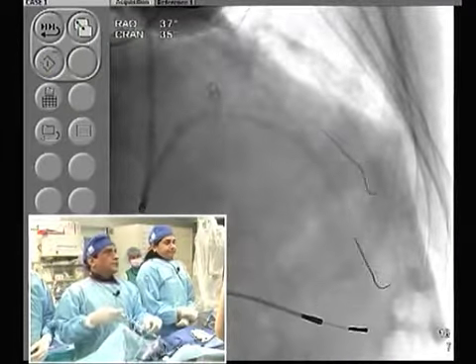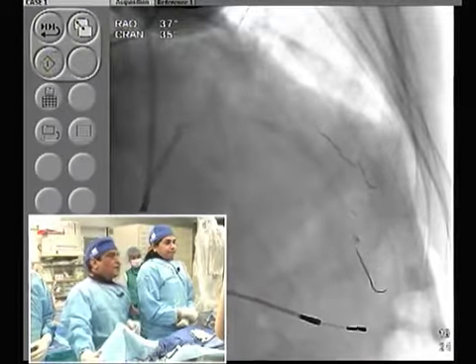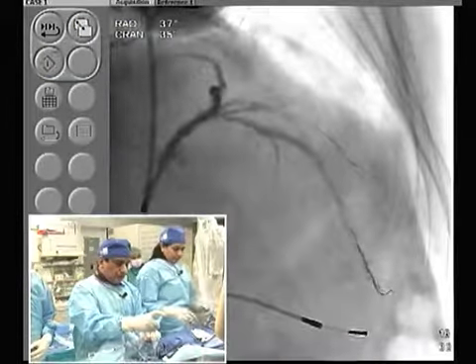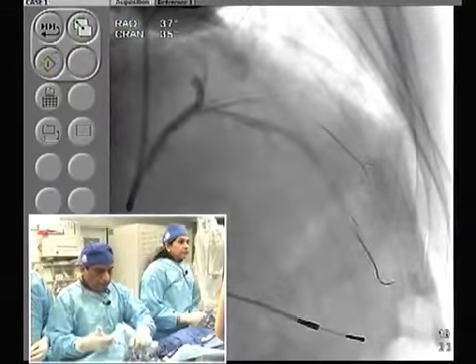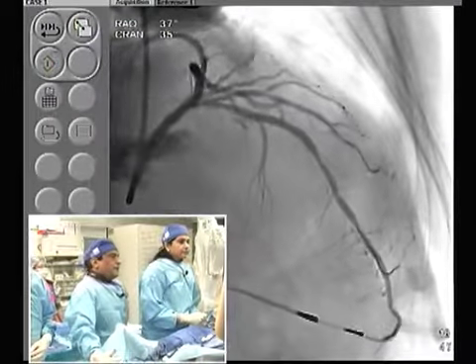See, the LAD is looking all right. It is typical that wherever you put a stent, the distal area will look a little more inflamed. We have not given any vasodilator. There is no question in our mind that the disease was always there, but that will probably be more of a spasm, a little vertical displacement of the plaque. But let's concentrate on the diagonal first.